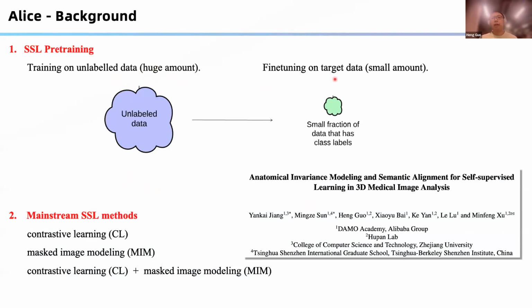If this training paradigm is effective, we can regard it as the model learning better anatomic embeddings during the pre-training process, thus providing improved network initialization for the fine-tuning stage. We gave this work a beautiful name, Alice, which observant viewers might have noticed is hidden in our title.